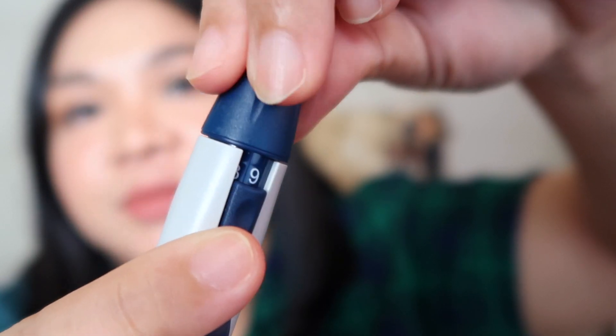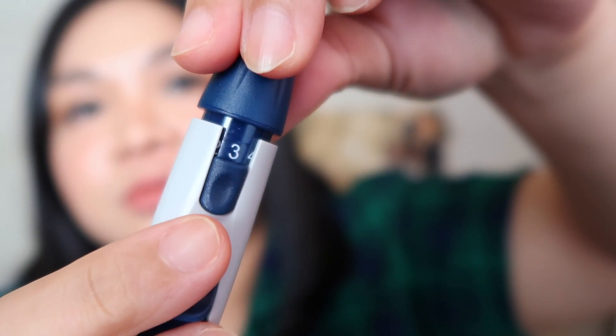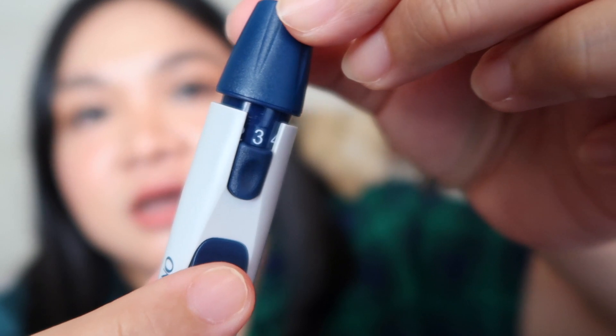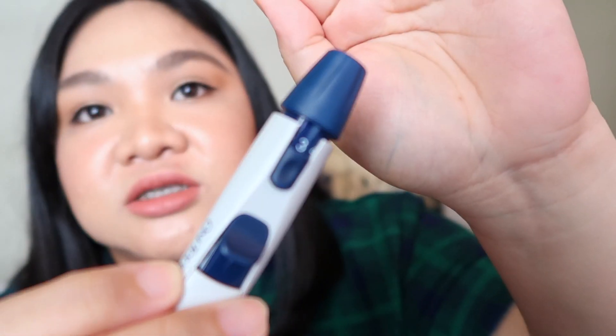Nine is the deepest. I have mine set to three — that's my puncture depth. You can adjust it based on how deep you want. Once it's ready, just simply cock it and then punch it when you're ready. Before you take blood, prepare your test strip first.